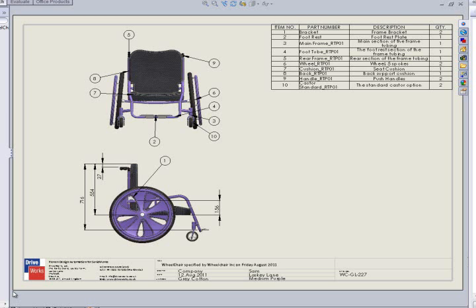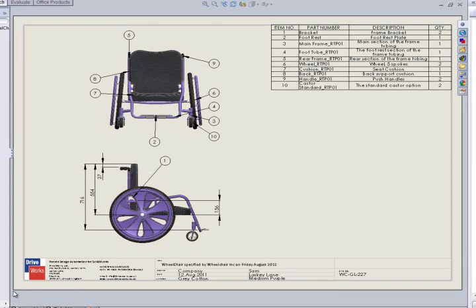On the first sheet, the annotations and dimensions have been driven to a position so that they are not overlapping. The balloons have also been driven, and the bill of materials has been populated with a quantity, description, part number, and item number.